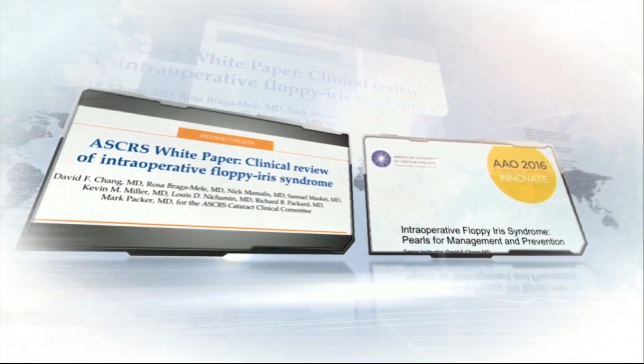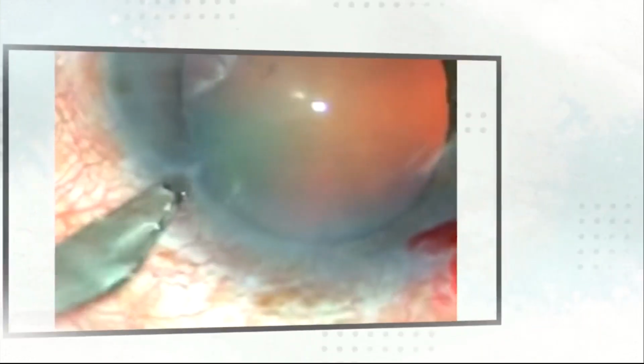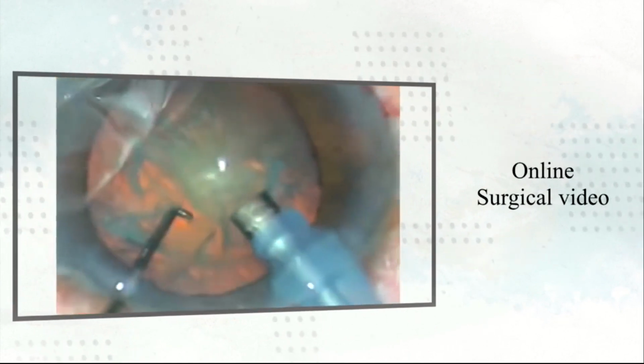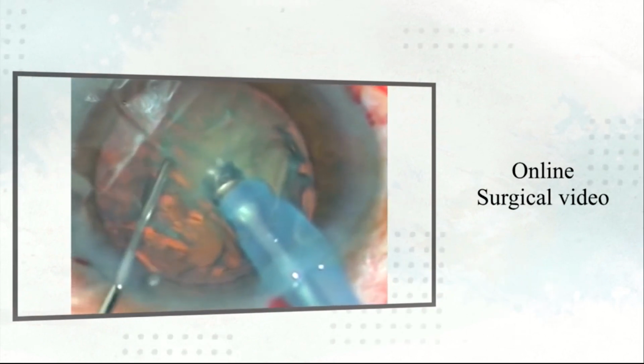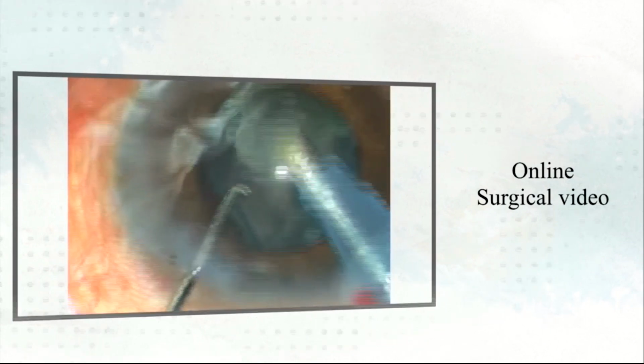We did a thorough literature search to find the missing link. The improper calibration of side port incision is one of the major precipitating causes. There was a flux of fluid to the side port incision with iris touching the side port instrument, thereby precipitating IFIS.